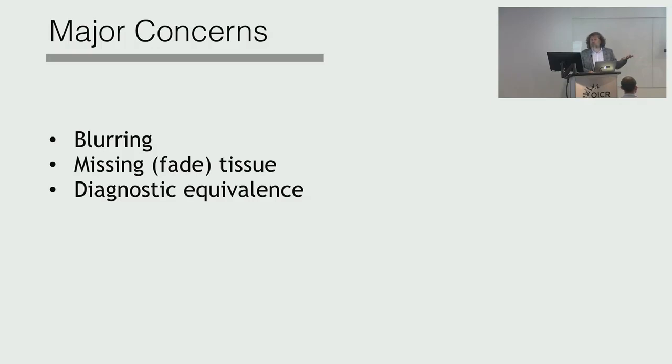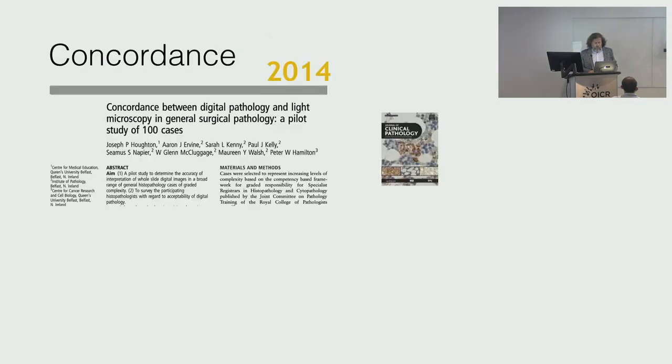So if I diagnose a patient based on an image and based on the microscopy, would that be the same? That's the most fundamental question. It doesn't matter that here and there may be discrepancies in the actual technology. There are a lot of concordance reports in the literature. I just grabbed three that seemed important to me.